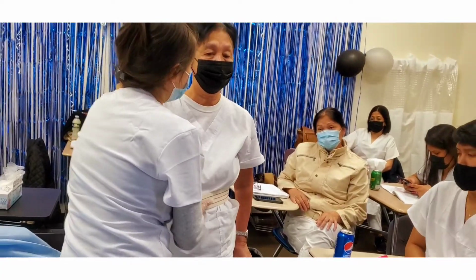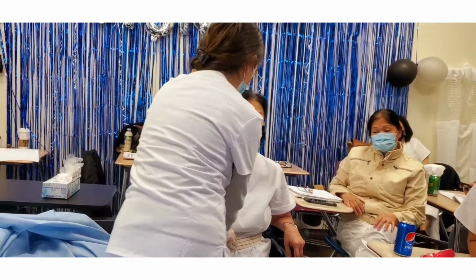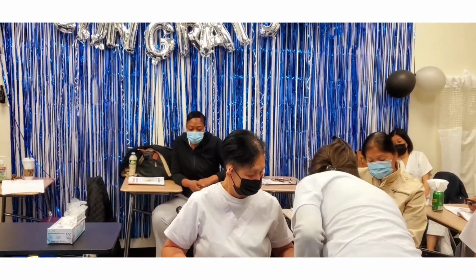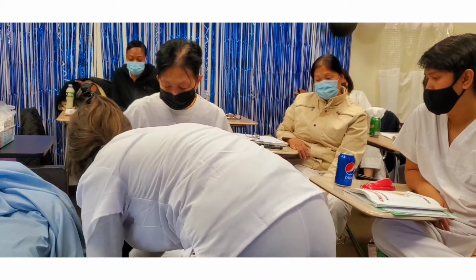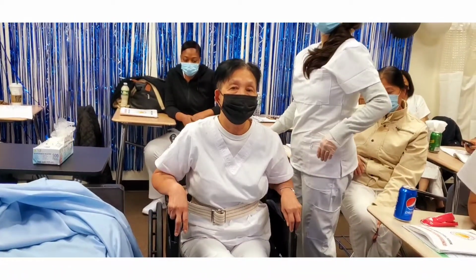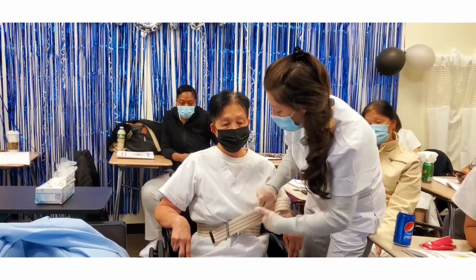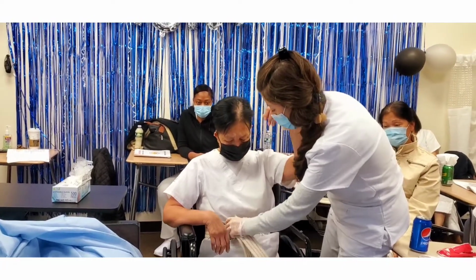Okay. One, two, three. Bend your knees. Mm-hmm. Good. Perfect. How do you feel? I'm okay. Good. Great. So I'm going to unlock the wheelchair. Put the pedals down for her feet. And I'm going to remove her gait belt. Yes, I unlocked it. Remove your gait belt. If you can raise your arms upwards for me so I can remove your belt.